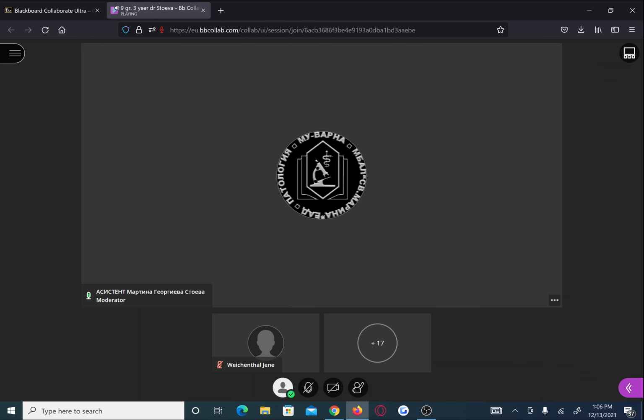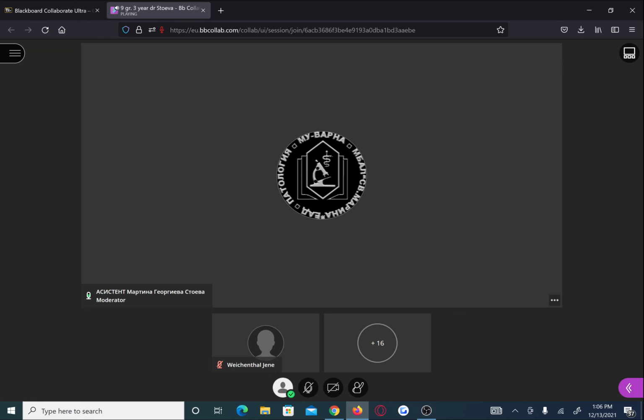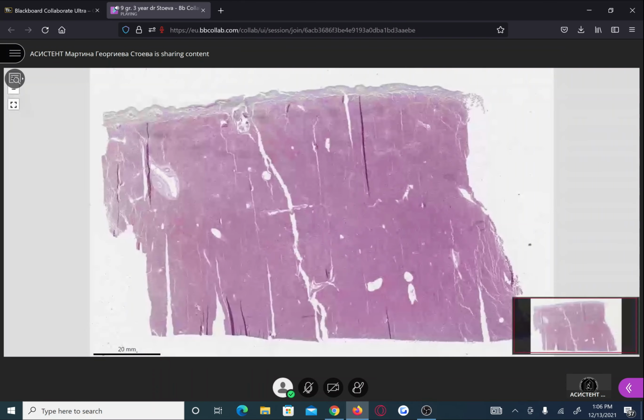We continue with the revision of the slides. The next slide is slide number 14, brown atrophy of the liver.